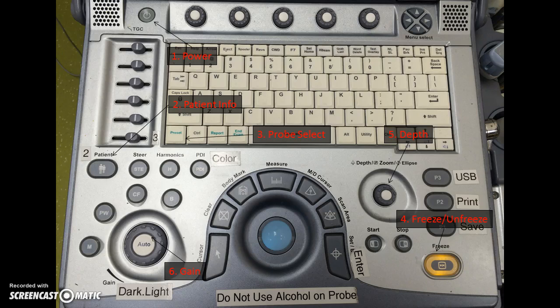So in this week's assignment, I wanted to document a graphic organizer where I showed learners how to use the ultrasound machine. And so I thought in some sort of web-based format as well as in a lecture prior to going into the actual use of the machine that I would go through this sort of a layout and have this available to learners that they can pull up when they're going to use the ultrasound in real time.